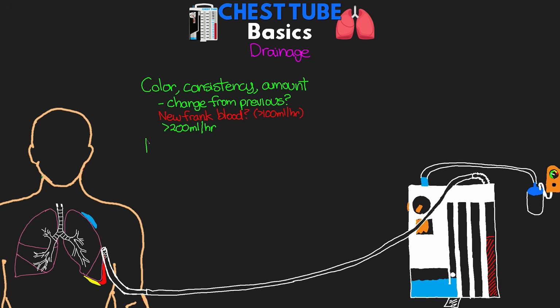Now, when it comes to monitoring this drainage and this output, initially we're probably going to be recording this at least hourly. Obviously, for certain situations, we may actually be doing this more frequently than that, but typically initially every hour we're going to be doing this.